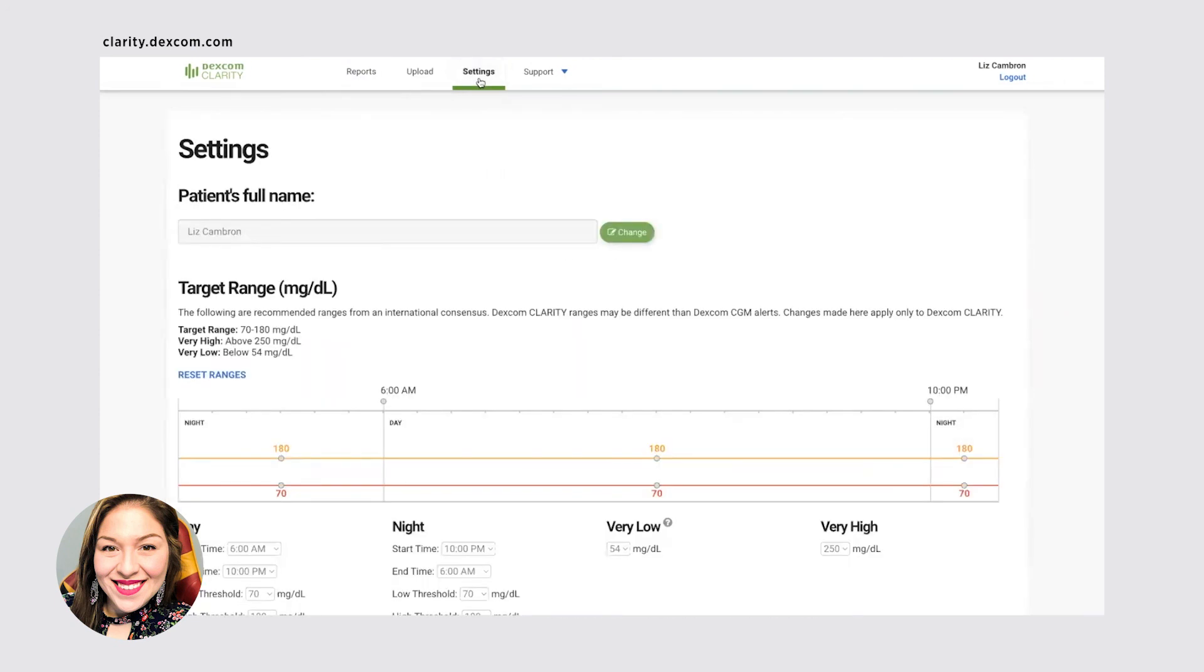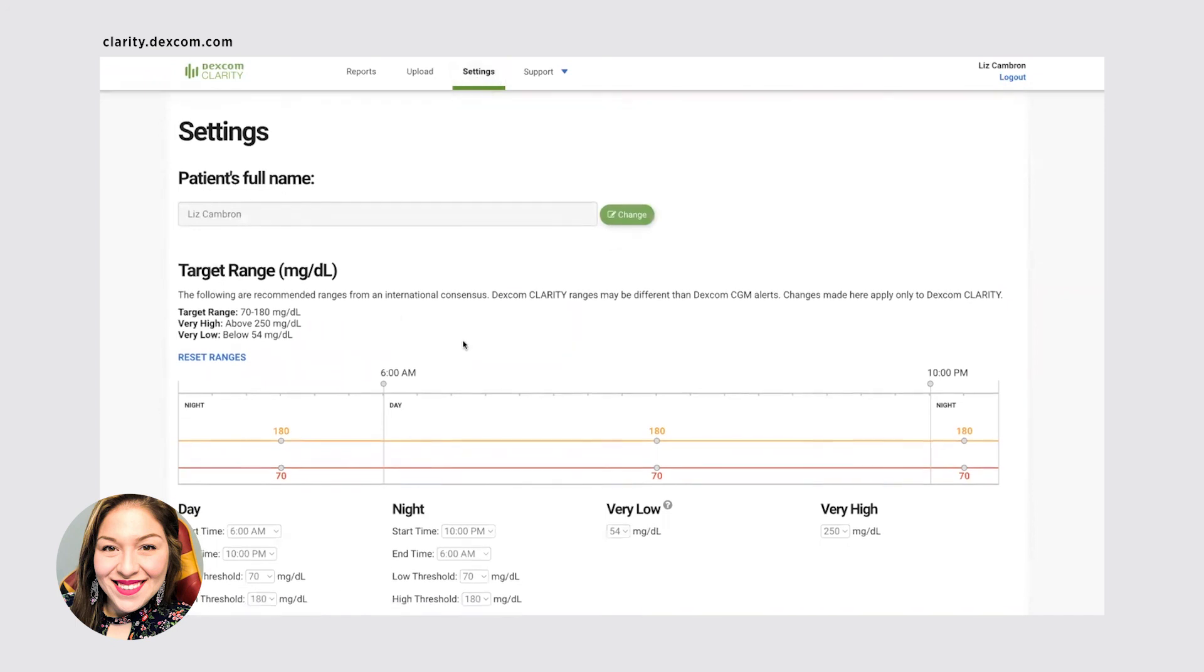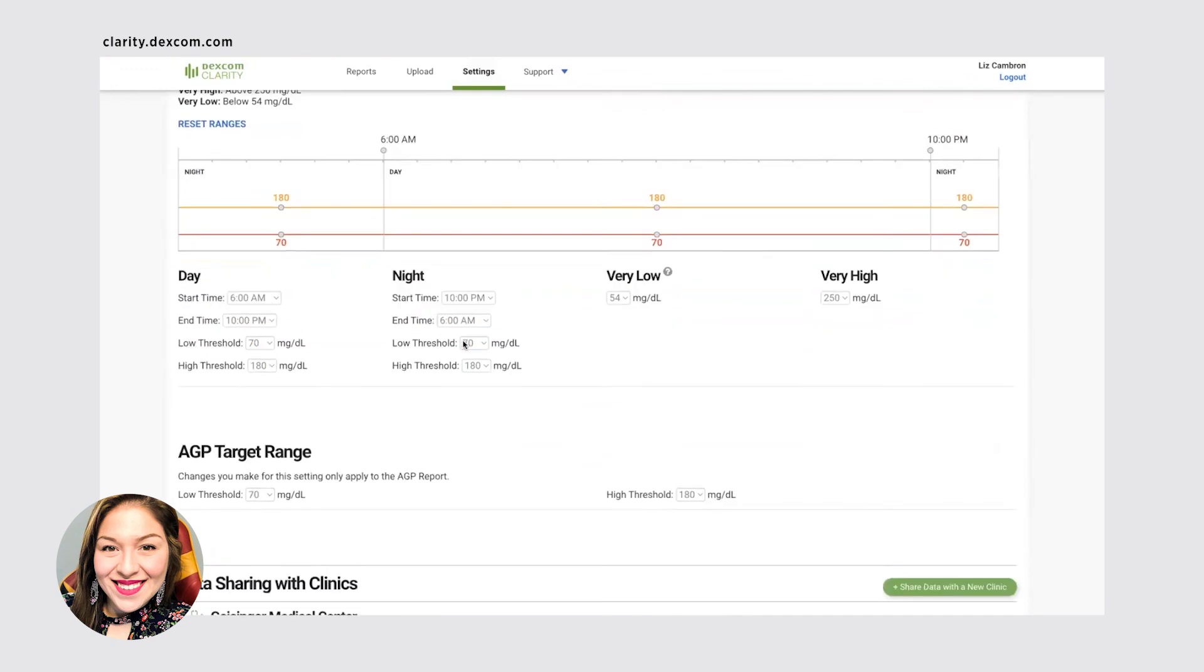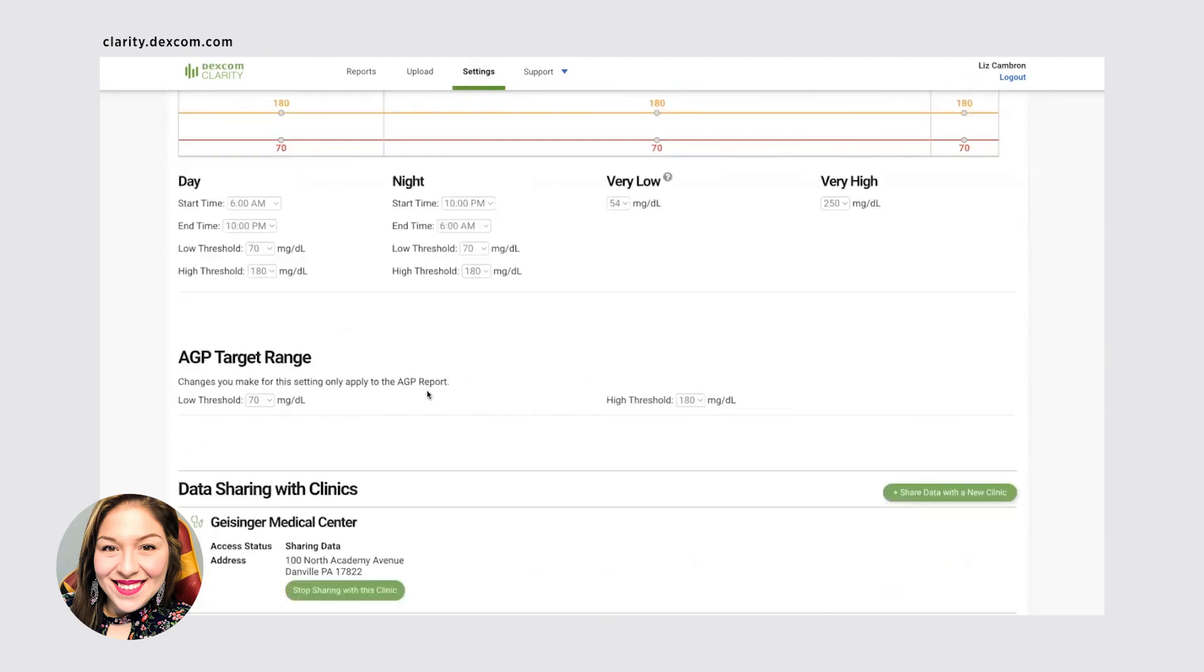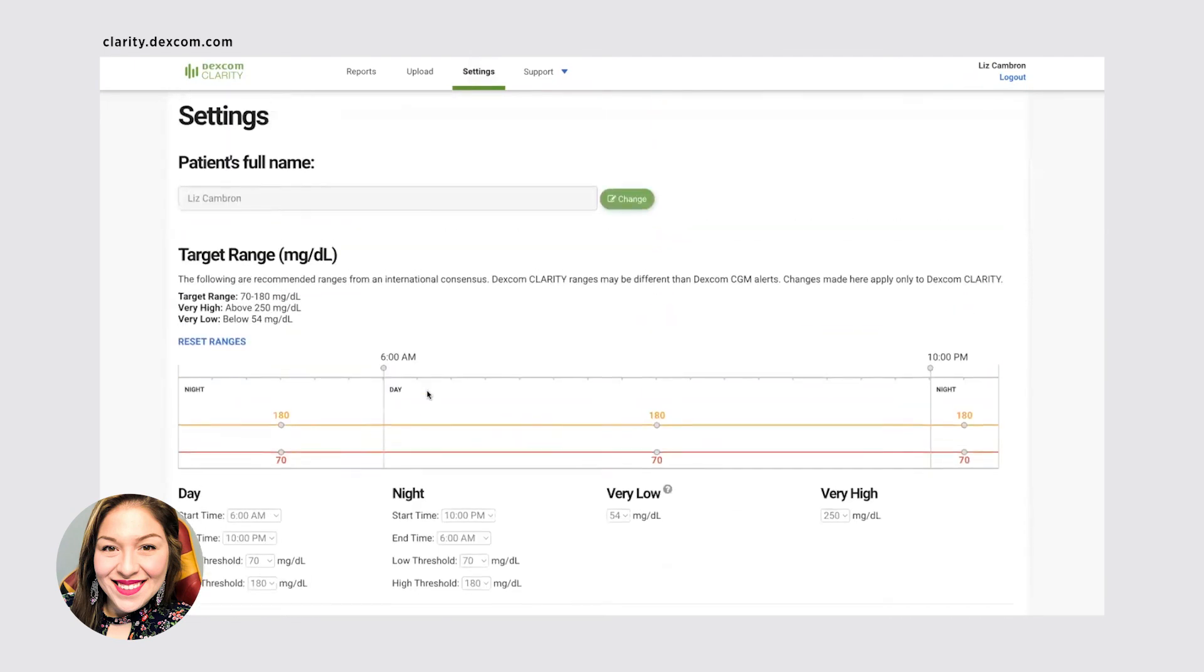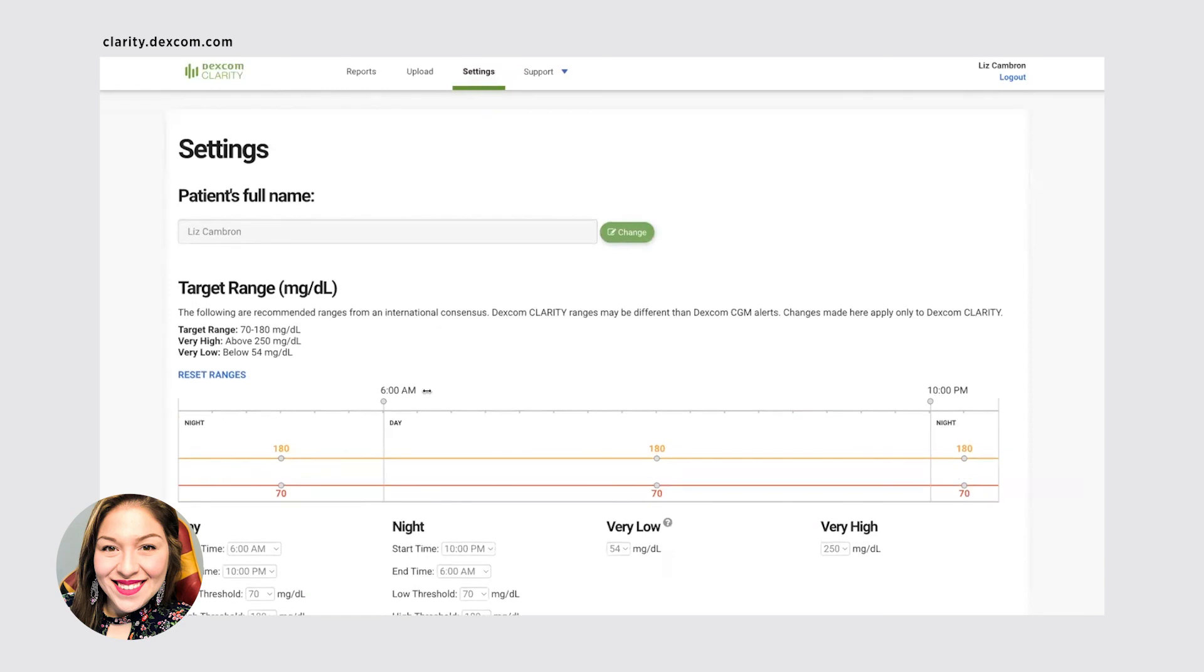This also has a settings, just like the mobile app did, where you can adjust what your target range is. You can adjust when your timeframes are. So if you want to adjust your very low alarm, your very high alarm, that way it shows what your thresholds are. So in the graphs, you can kind of see what you're, if you're in that range. You can also see what clinics you're sharing your information with. So this is really helpful for you to know who's getting your data and what data they're getting.